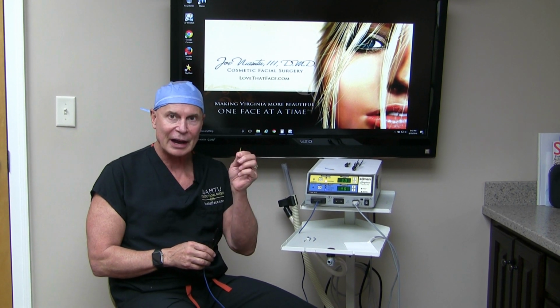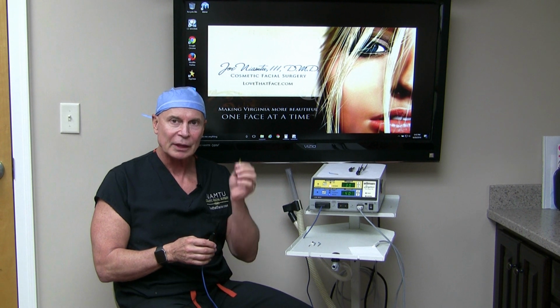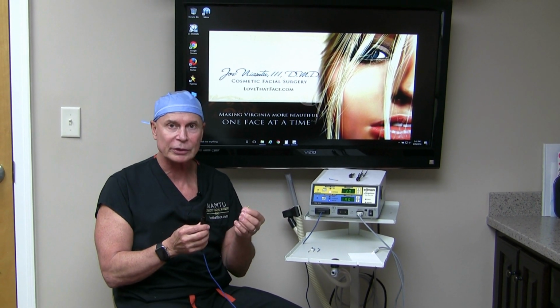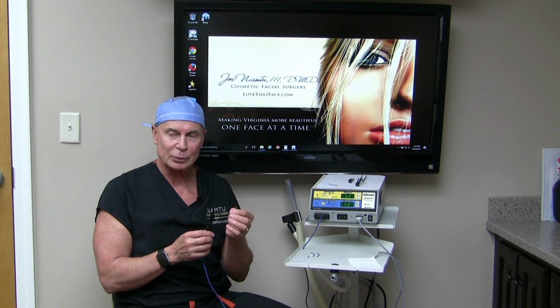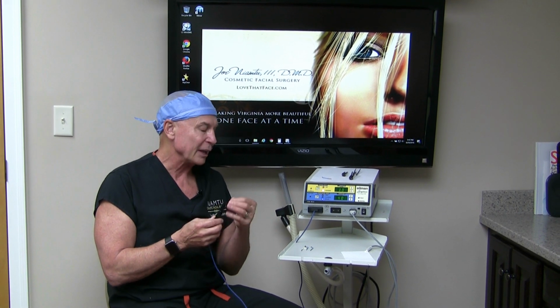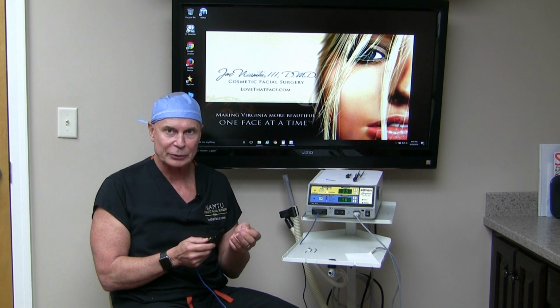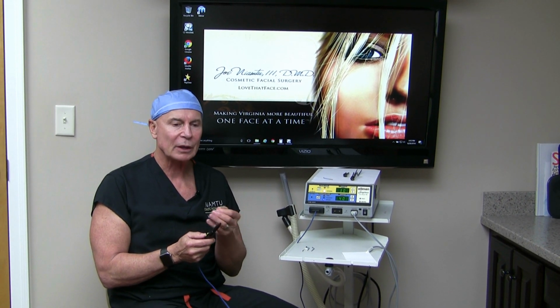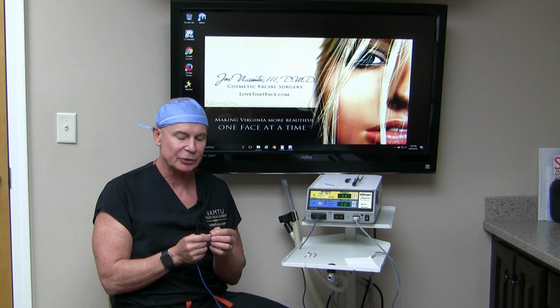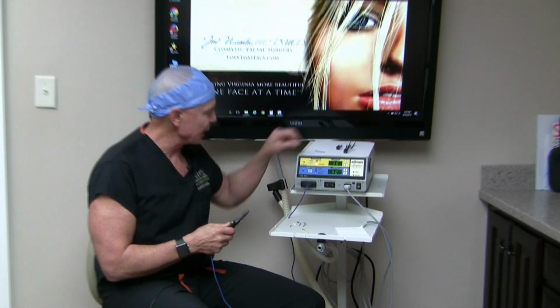And so this never gets hot, unlike electrosurgery where that can get red hot and melt. In electrosurgery, the tip or the electrode provides the resistance. In radio wave surgery, it is the tissue that provides the resistance, and that's why it is more gentle and very hemostatic. So in a lot of respects, clinically, they work the same. That's both an electrical source, but if you look at this histologically, you have a lot less lateral thermal damage with radio wave. So these electrodes go into your handpiece.